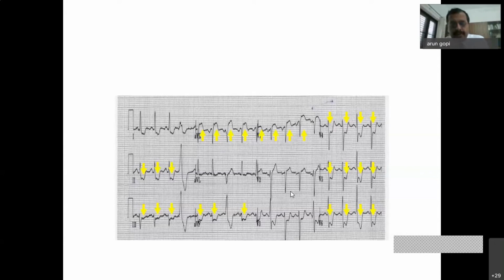So moving on from acute coronary syndrome, the other entity where ECG is very clearly diagnostic is arrhythmias. This is the classical sinus rhythm, where you have a normal P wave followed by a normal PR segment and a normal QRS. In people who have an accessory pathway connecting the atrium to the ventricle, you tend to have a very short PR interval, a slurred upstroke of the QRS, and a wide QRS, which forms a triad of what we call Wolff-Parkinson-White syndrome. They are predisposed to various forms of supraventricular tachycardia.